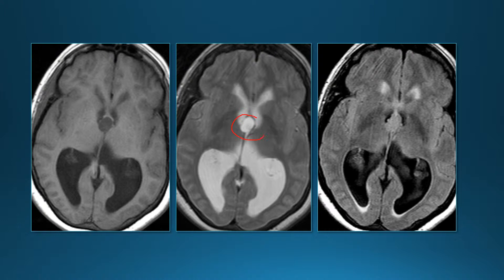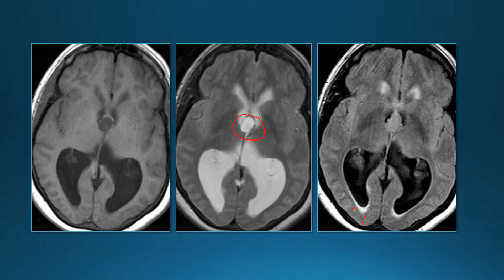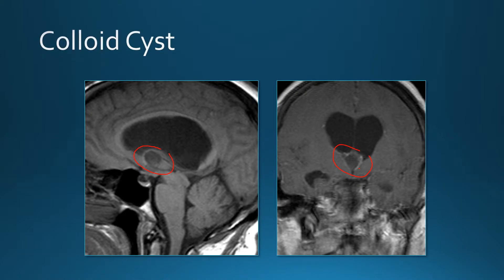There's a mass in the anterior third ventricle near the foramen of Monro, in this case causing hydrocephalus. You can see a little bit of transependymal edema. On the sagittal image here's the lesion; on coronal post-contrast there's no solid enhancement — maybe a little bit of rim enhancement, but no solid enhancement. We're dealing with a colloid cyst.